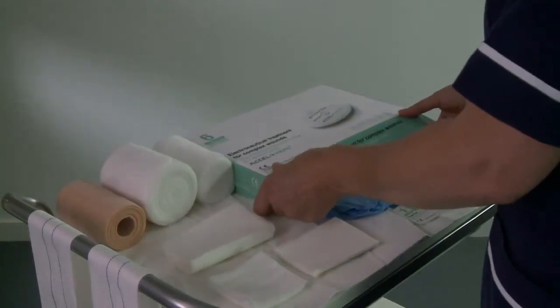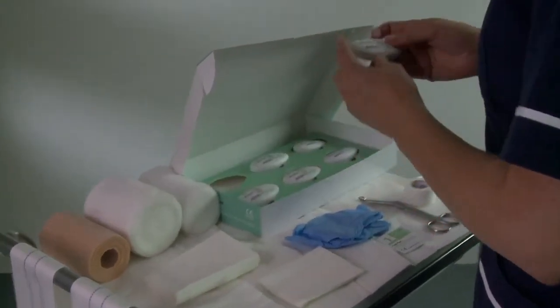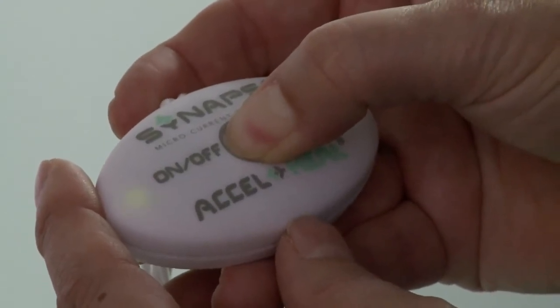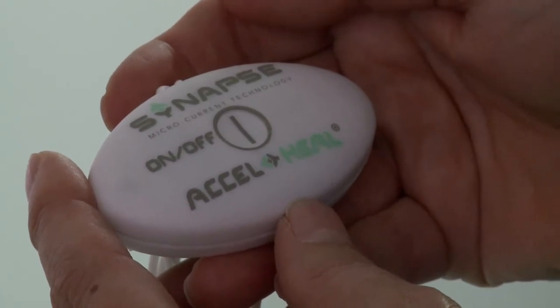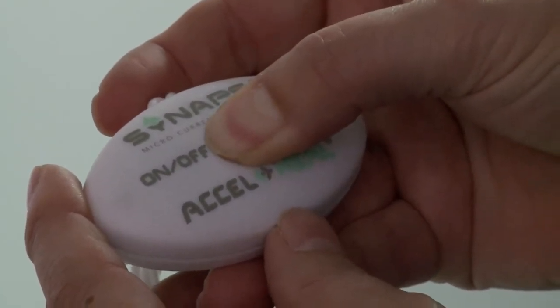Prior to proceeding, please test that the Axel Heal treatment device is fully functional. Do this by holding the on/off button down for two seconds. A fast flashing green light will indicate that the device is fully operational. Turn it off by holding the on/off button down for two seconds.